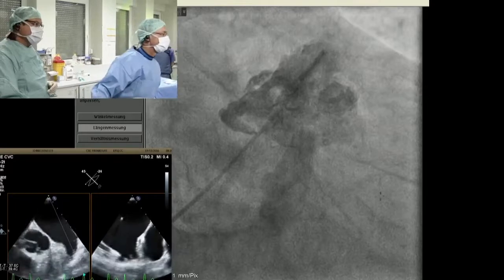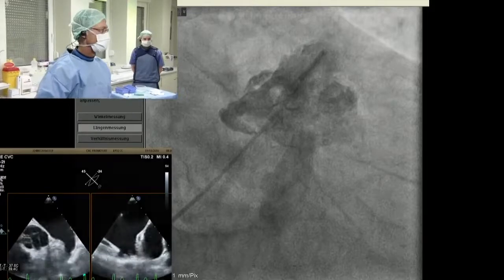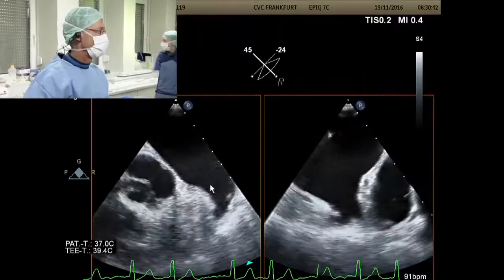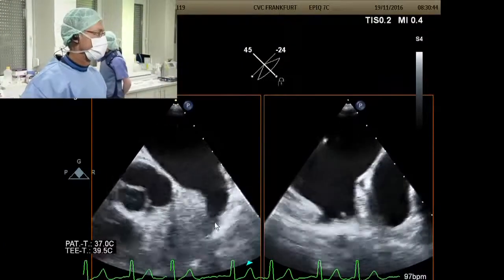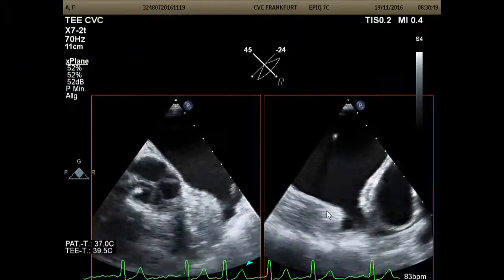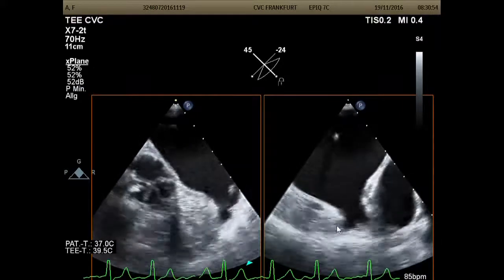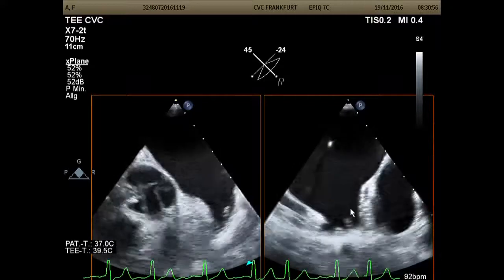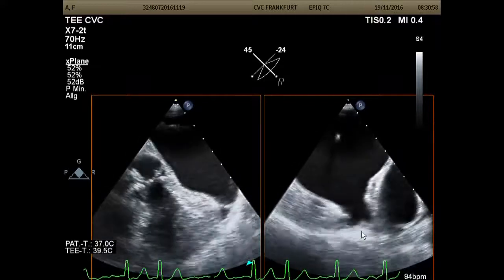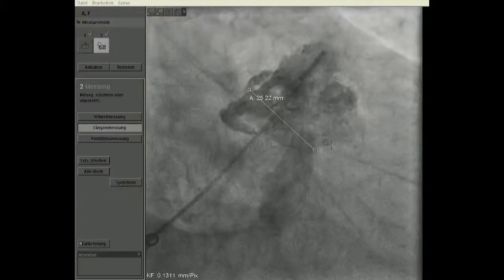Ballpark idea. We've got the 45 degree view on the left and on the right you've got your 135 view. You can see the orifice is quite broad. It narrows rapidly to a short lobe, and then in the orthogonal view you can see the circumflex vessel coming in here. So this would be our landing zone, and then you can see we've got 3 very short lobes, and this is the PA, so the anterior lobe is here. Yeah, that would qualify as one of the more broccoli type, where it's broad-mouthed and shallow in depth. Probably a challenging one, yeah.